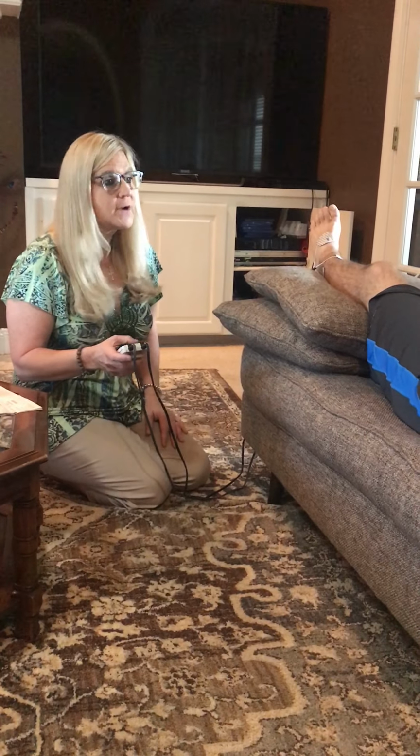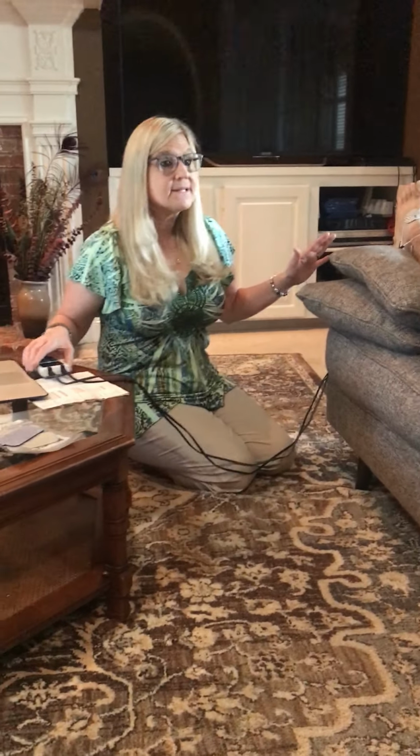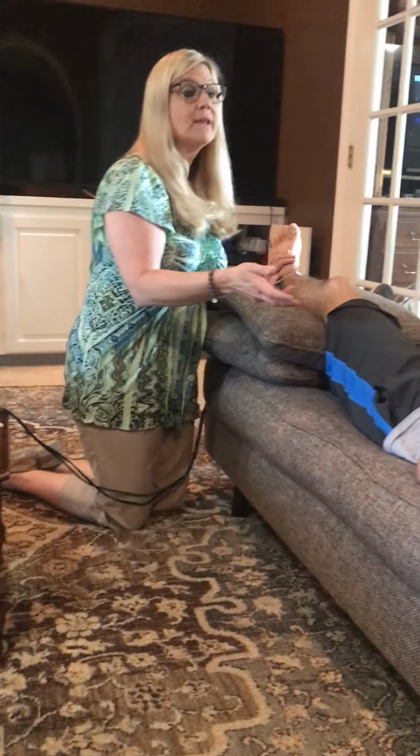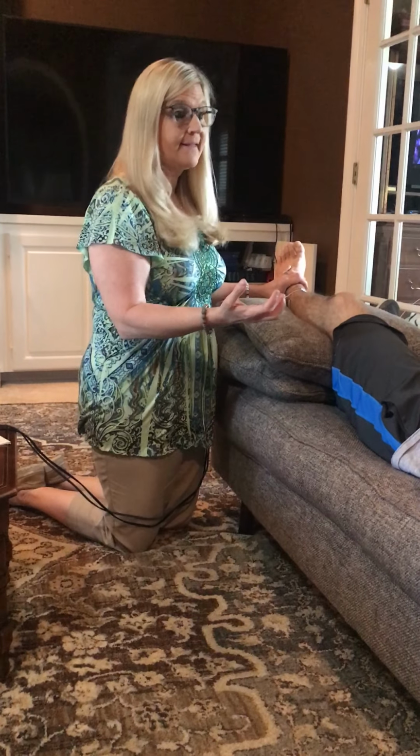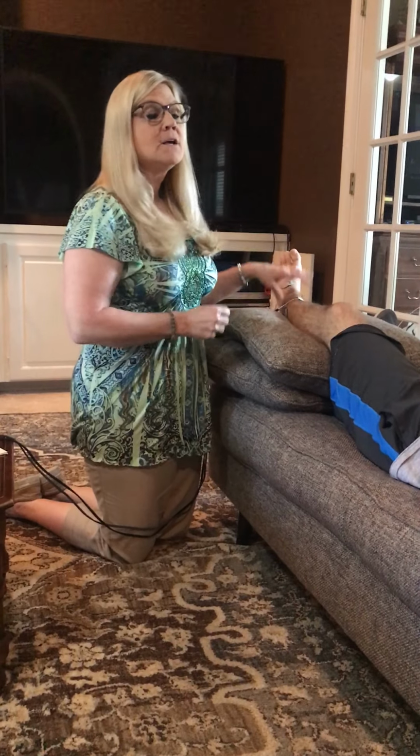Okay, so we're going to start our treatment. It's going to be about 20 minutes. So I'll give him a call button, and you let me know if it starts to hurt worse, you feel pain or burning or anything like that out of the ordinary. So come back in 5.